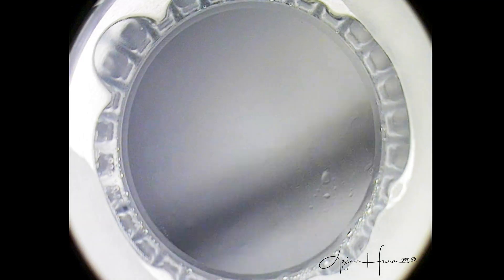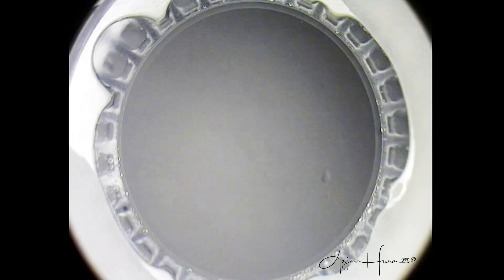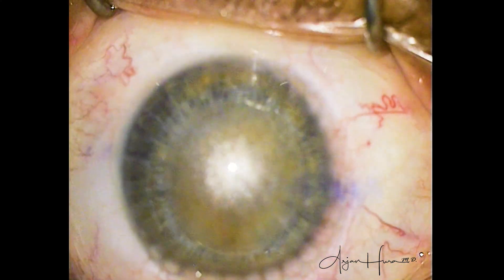This will not affect the patient's final visual outcome — they will still be seeing 20/20 or 20/15 on day one. However, you cannot proceed with the SMILE treatment if a suction break happens during the last 90% of the refractive cut.